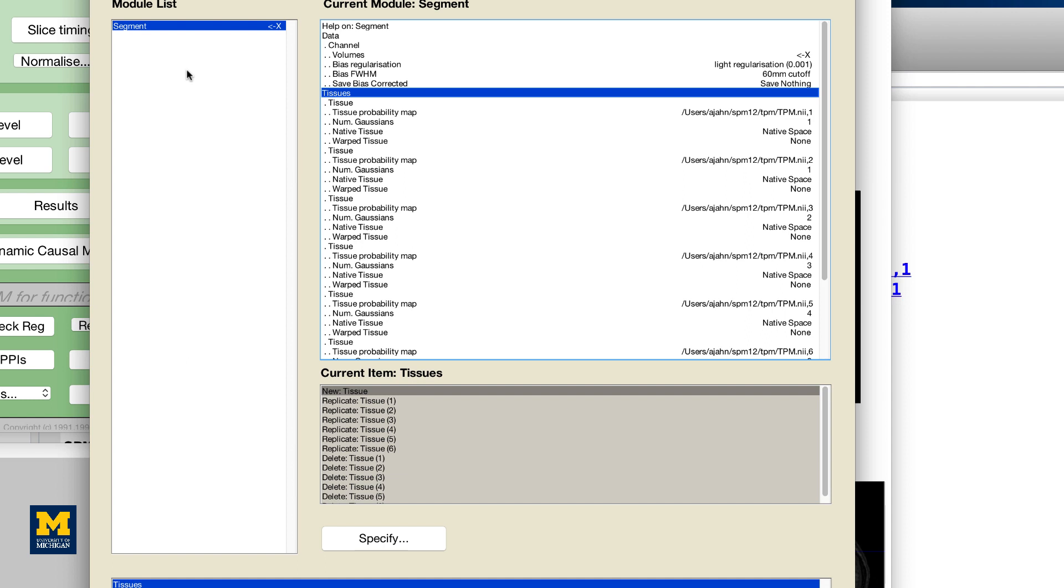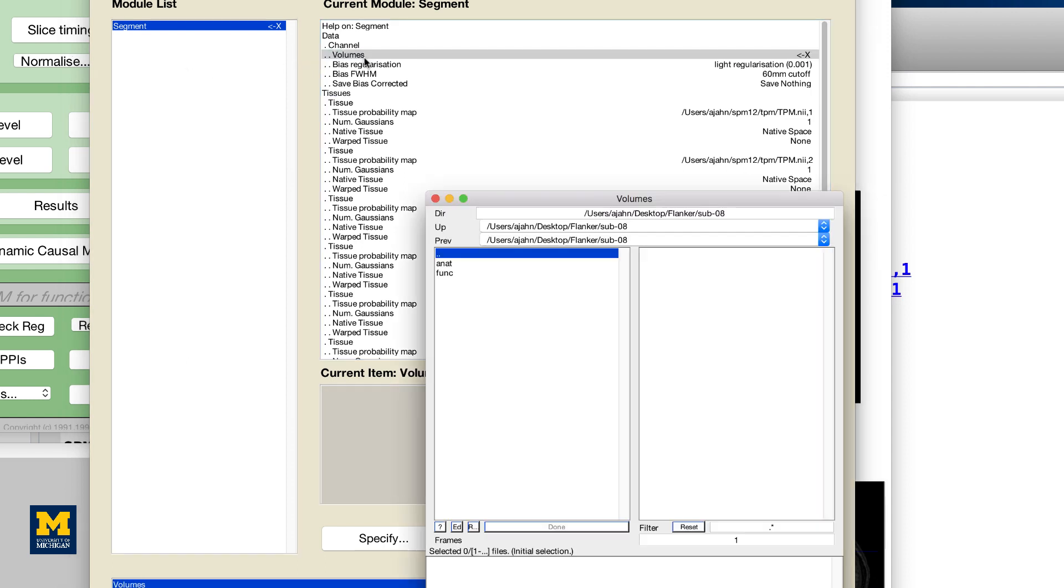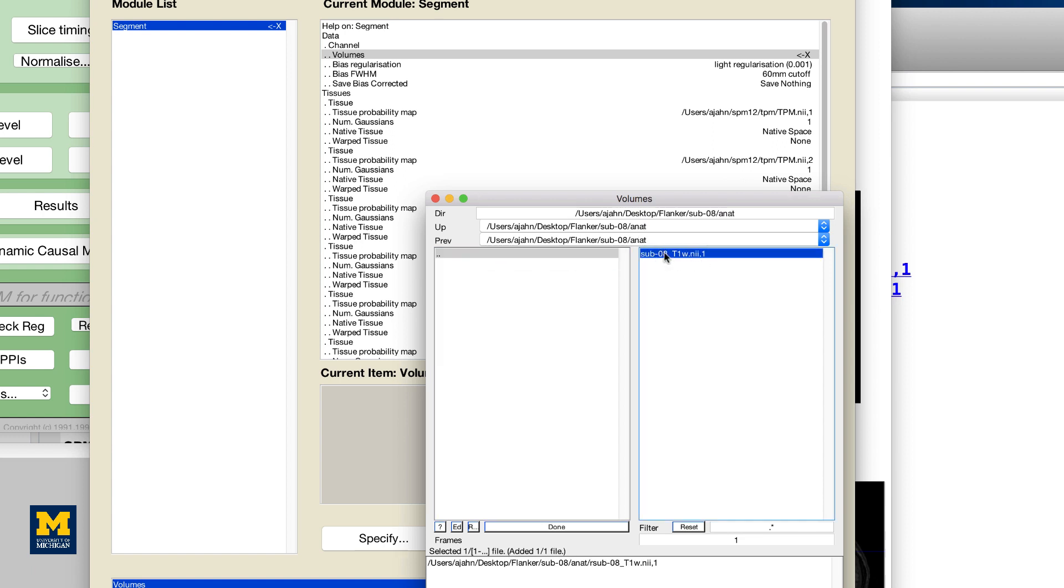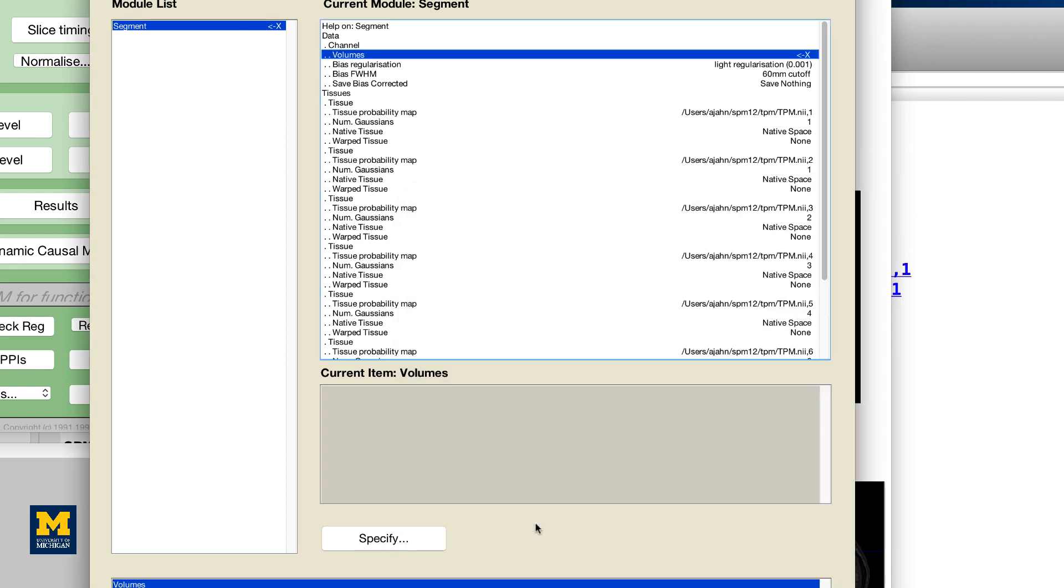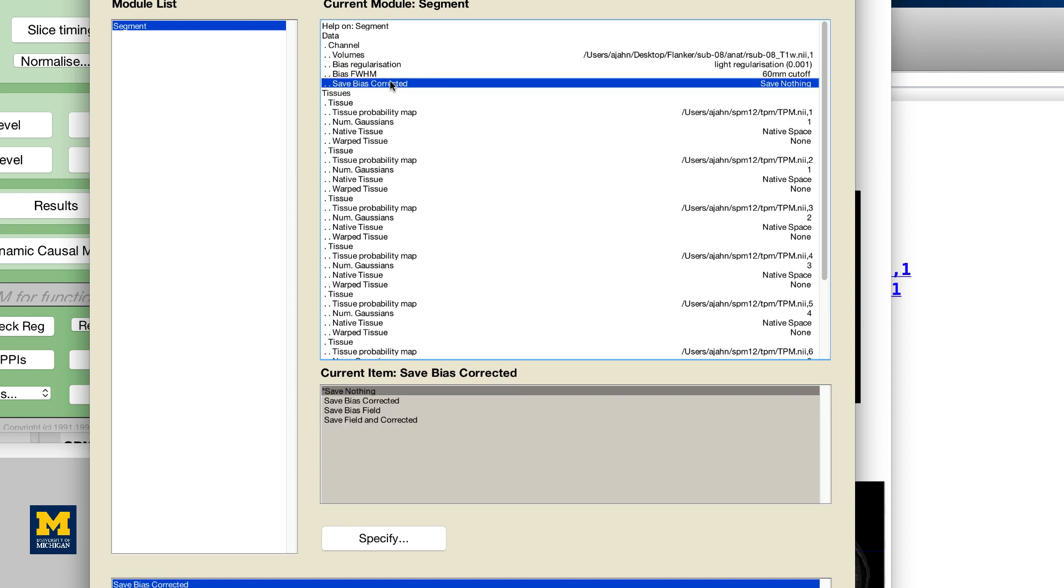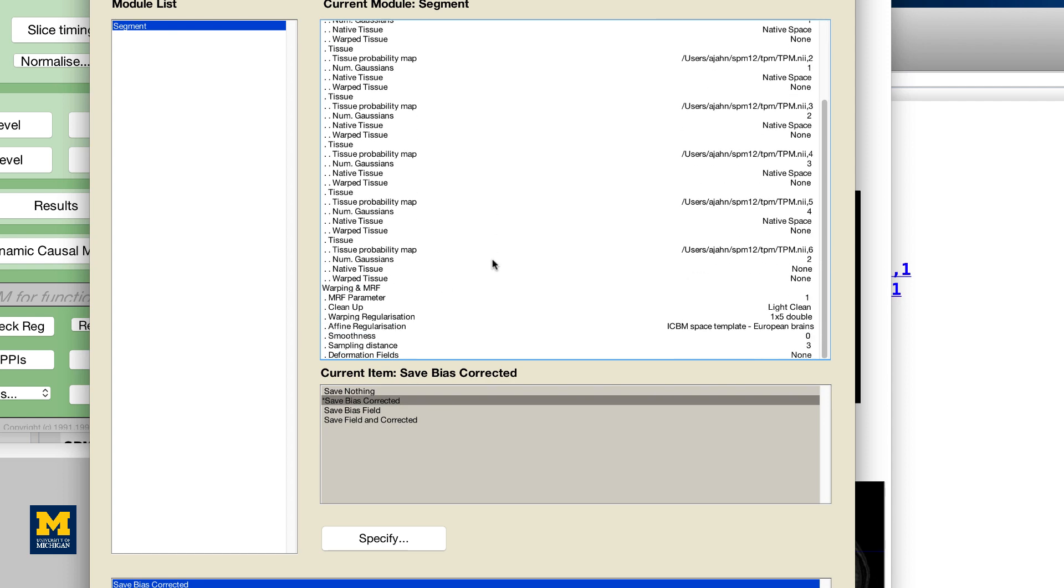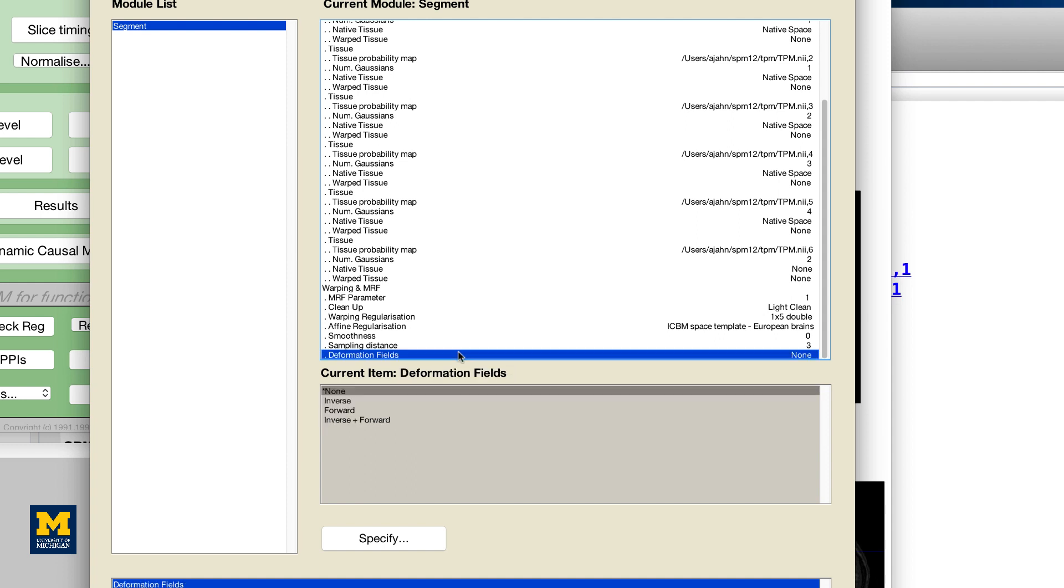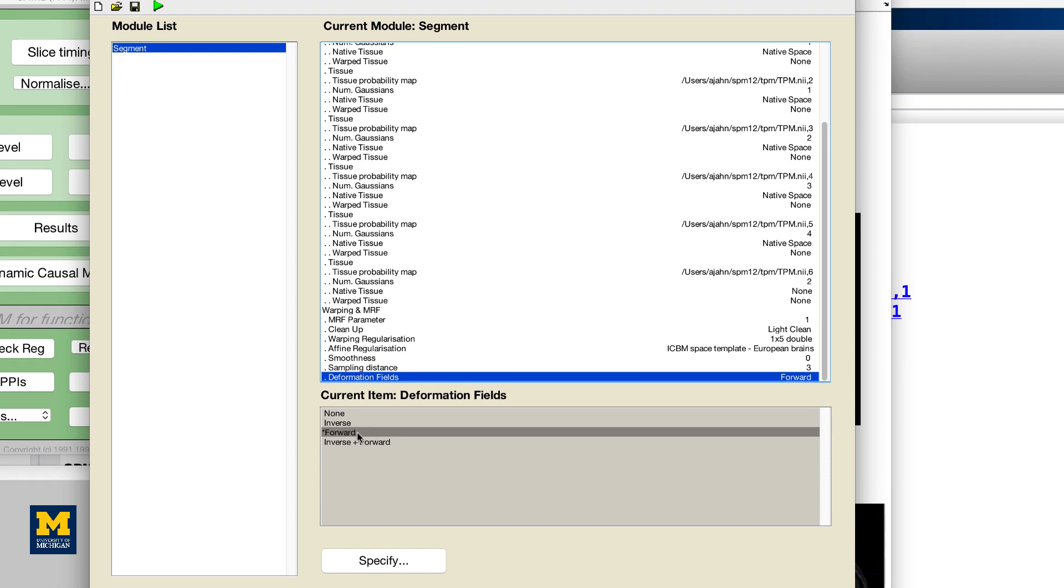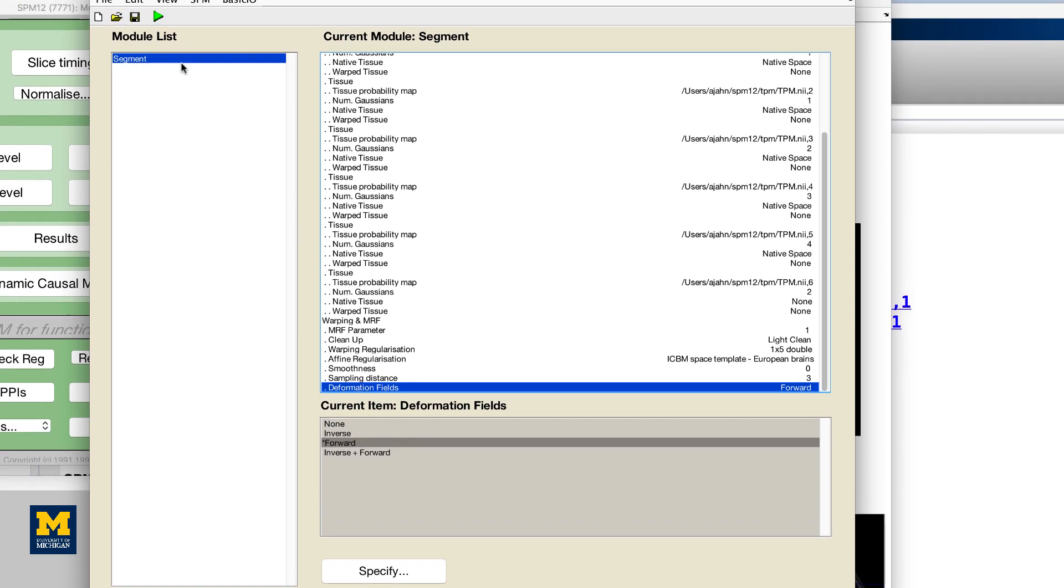Setting up the segmentation step only requires the realigned anatomical file as input. From the segmentation button, double-click the volumes field and select the file R sub 08 T1W, and then set the save bias corrected field from save nothing to save bias corrected. The last step is to change the deformation fields to forward. This is at the very bottom of the menu. When you have done all of this, click the green go button.